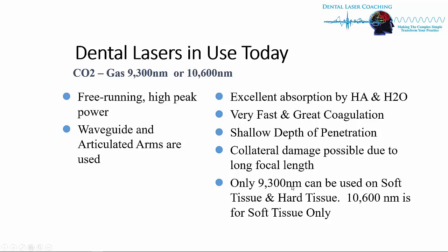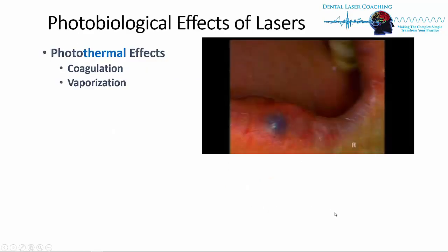And again, only the 9.3, which is a new technology, can be used on hard and soft. The 10.6, which is a majority of the CO2 audience, is for soft tissue only, a great soft tissue laser.